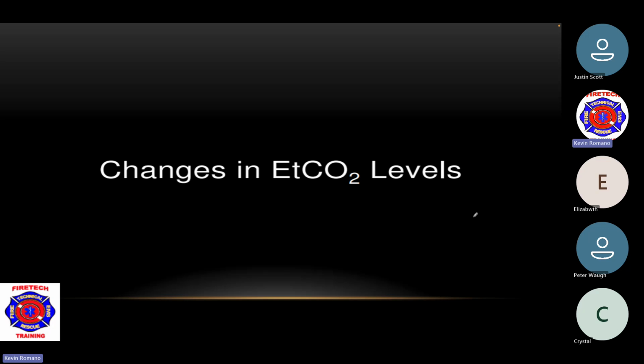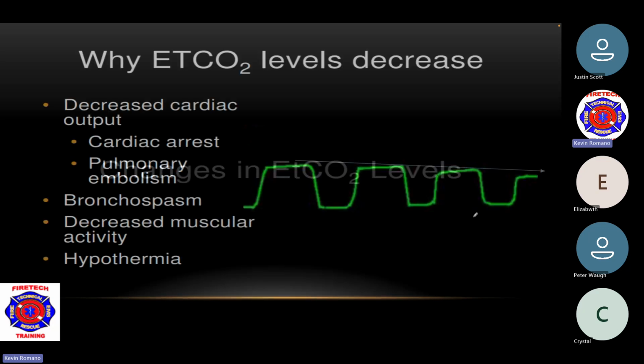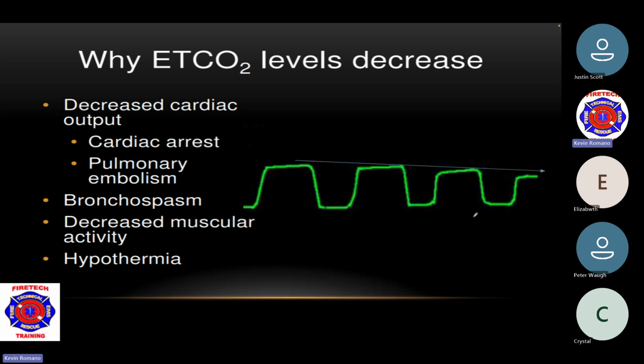And we'll continue on. All right, so changes in end tidal levels. Let's go into this stuff here. Let's dig deep. So why do end tidal CO2 levels decrease? Well, there's a lot of reasons why it could. Decreased cardiac output.